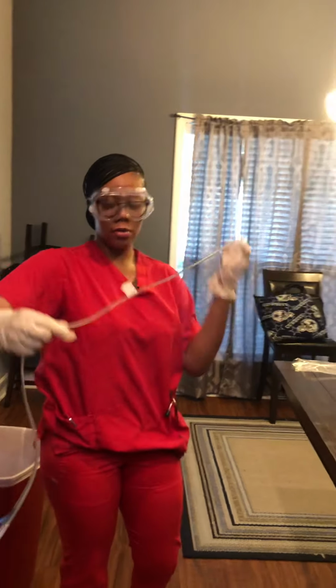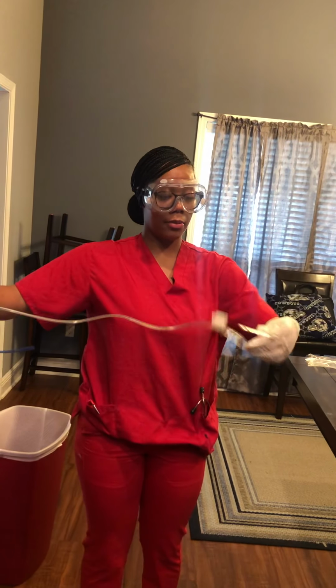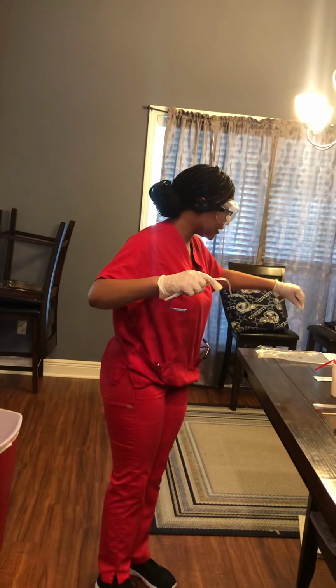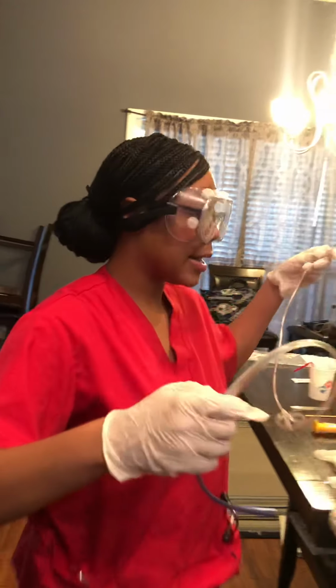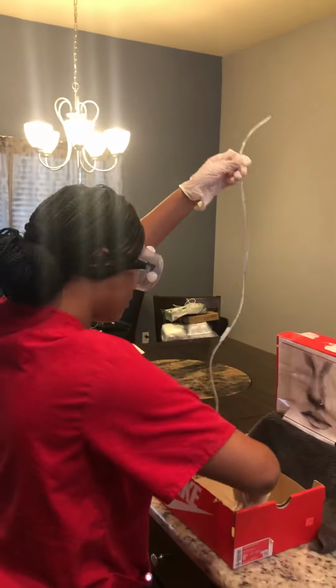Next, I will coil the ending of my NG tube over my fingers, now releasing it, and I'll be sure to lubricate the first 4 inches of my tube with my water-soluble lubricant. Now coming over to my simulated patient, I'll make sure that the curved ending is pointed downwards.